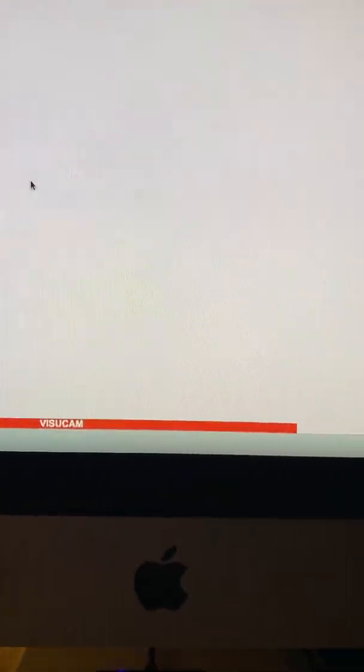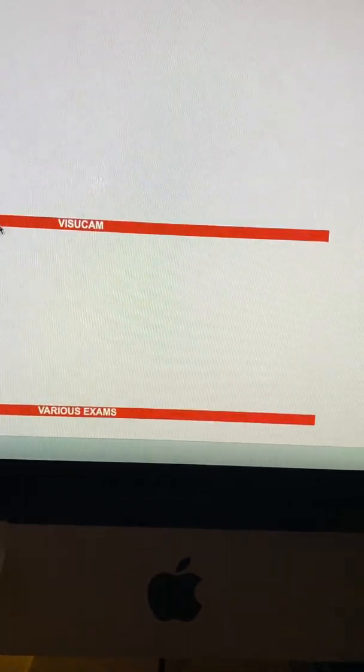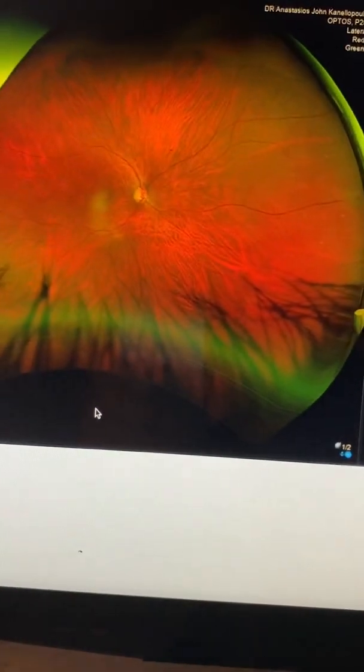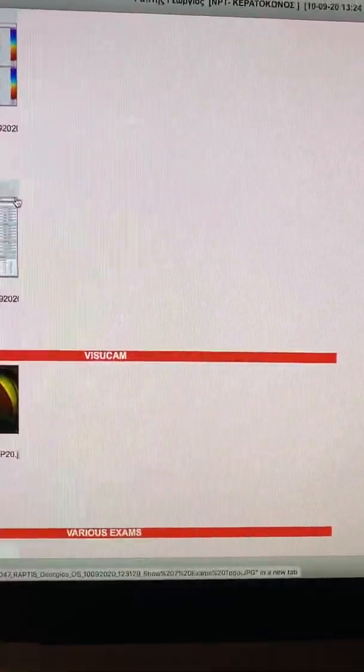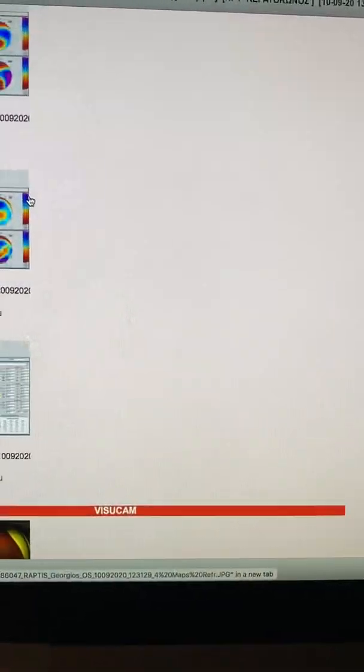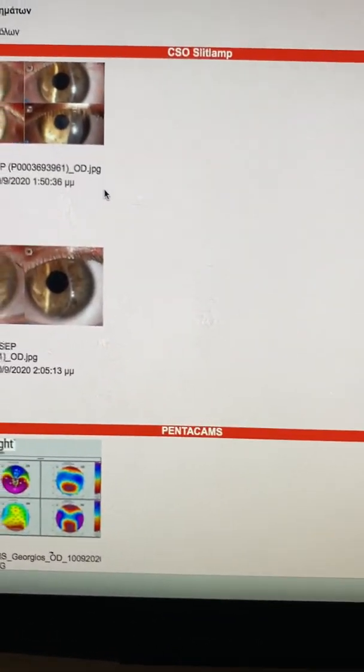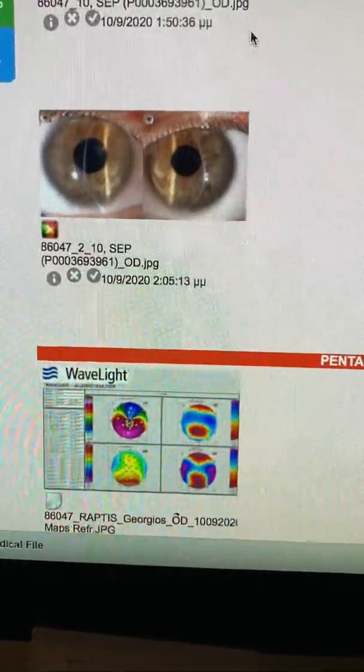And we're going to go to the fundus view, of course, as with every patient, very normal fundus. So we feel that this patient would certainly benefit from a cornea cross-linking.